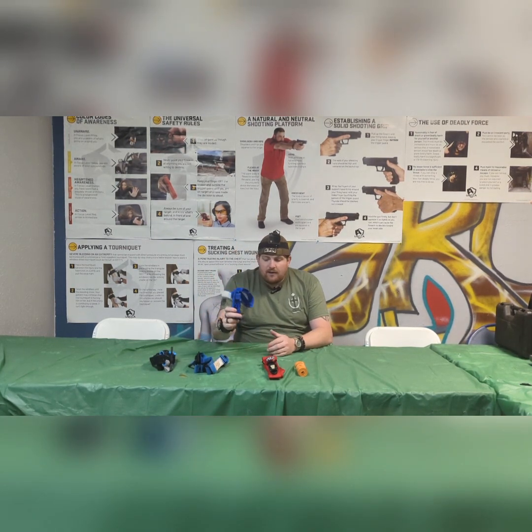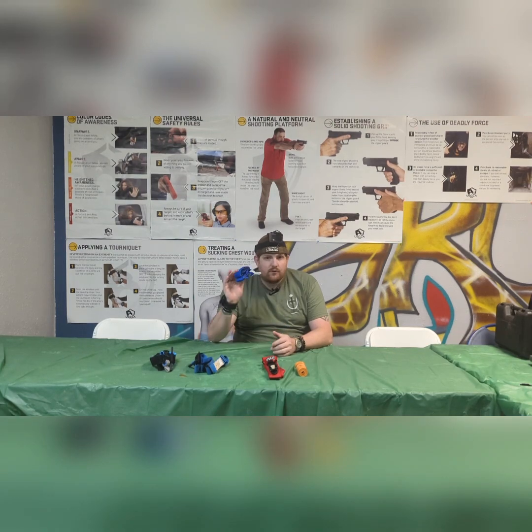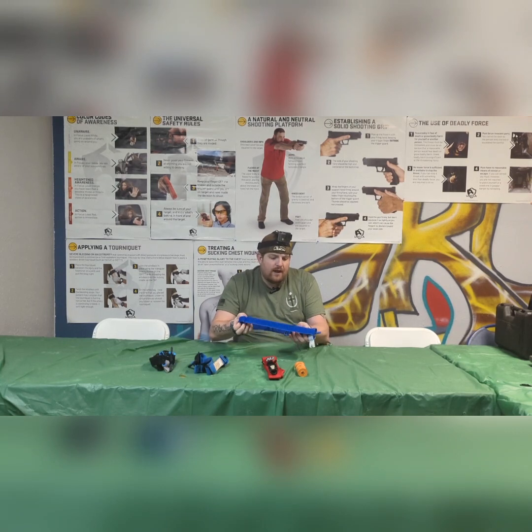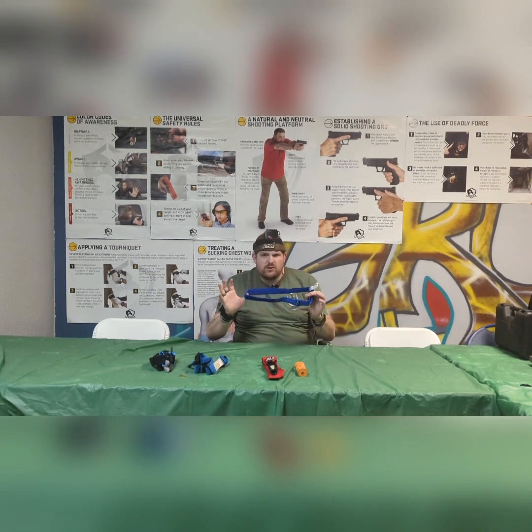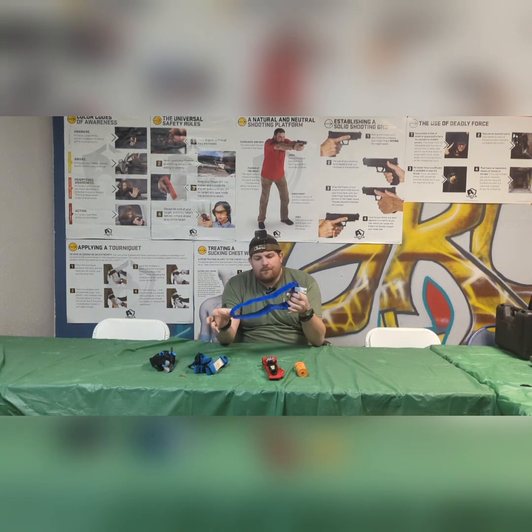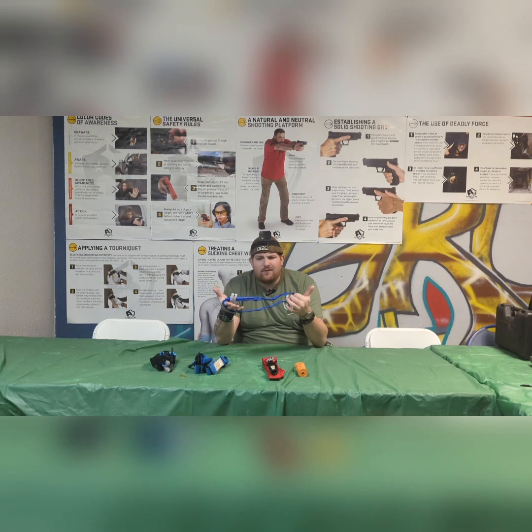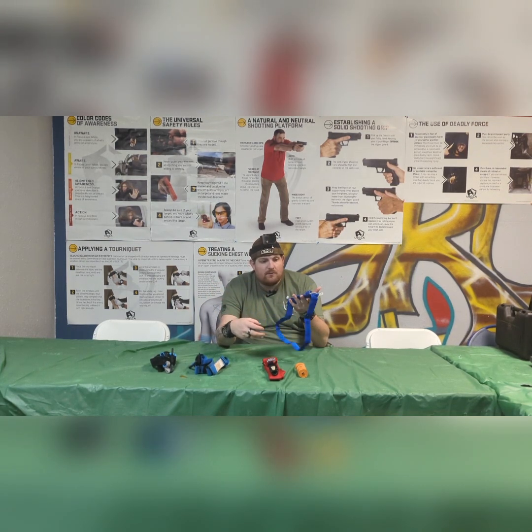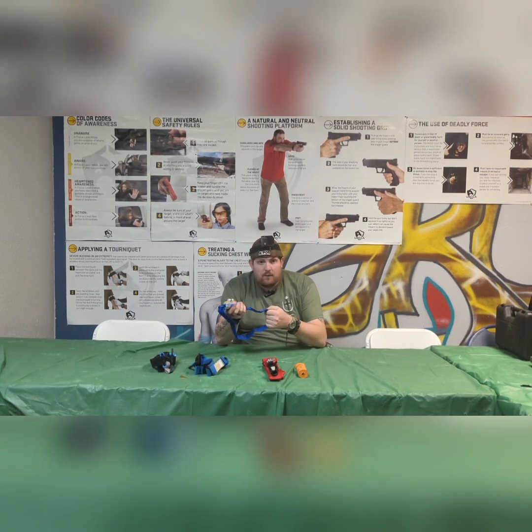Right here in the middle, first and foremost, we have the tried and true CAT tourniquet. Again, blue means trainer, red or green or orange is usually high vis, and black or tan is usually tactical. CAT stands for combat application tourniquet. I think they're on Gen 7 now. North American Rescue makes these. Great tourniquets. Look out for knockoffs. They're tried and true. This is what I used in the military. They work.